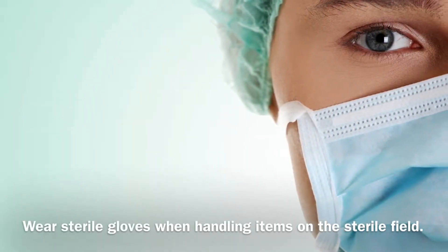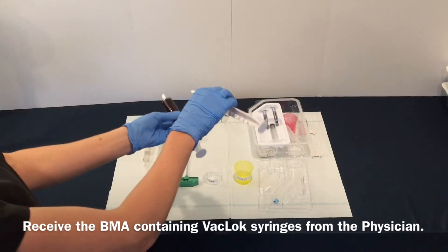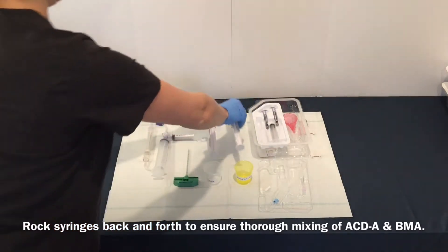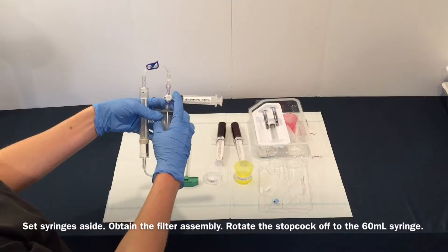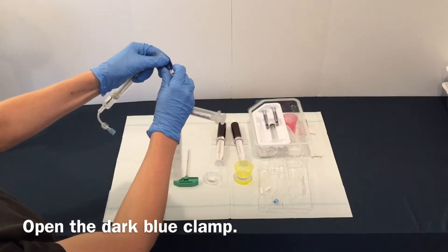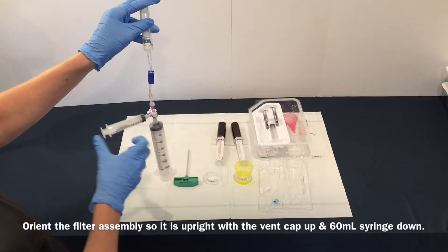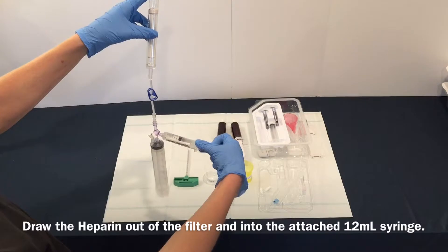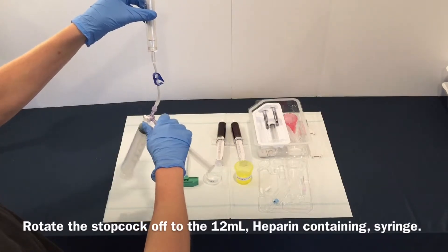Wear sterile gloves when handling items on the sterile field. Receive the BMA-containing vaclock syringes from the physician. Rock back and forth to ensure thorough mixing of ACDA and BMA. Set syringes aside, obtain the filter assembly, rotate the stopcock off to the 60 mL syringe. Open the dark blue clamp. Orient the filter assembly so it is upright with the vent cap up and the 60 mL syringe down. Draw the heparin out of the filter and into the attached 12 mL syringe. Rotate the stopcock off to the 12 mL heparin-containing syringe.